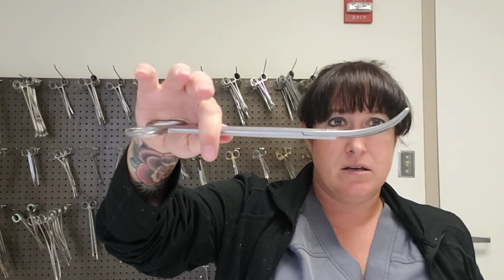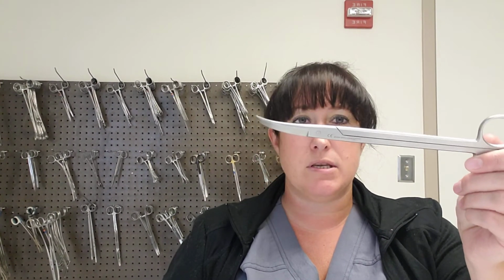Getting away from more delicate surgery, let's move to these funny things. These are very large. The longest ones I think I've shown you today. Let's compare them to our suture scissors. See, they're pretty long. The main thing about this is this very pronounced curve, right? These are called Jorgensen scissors.